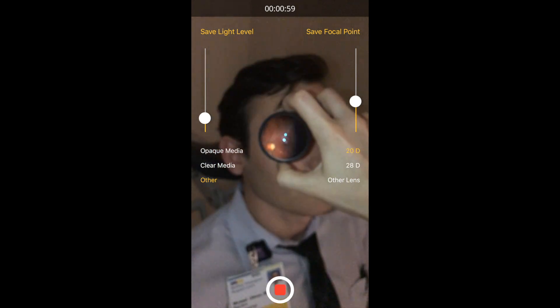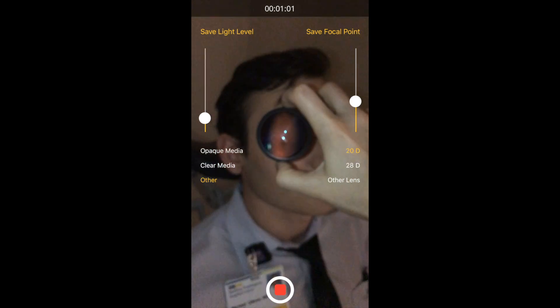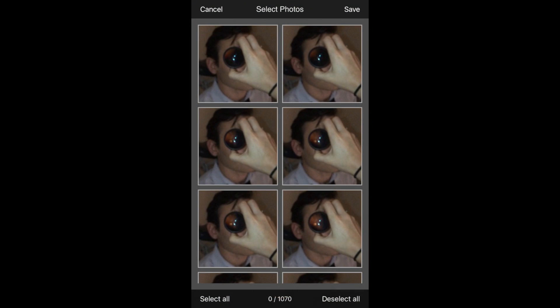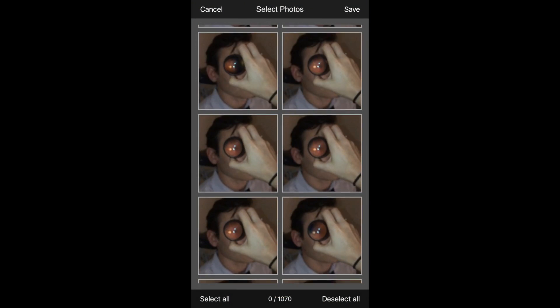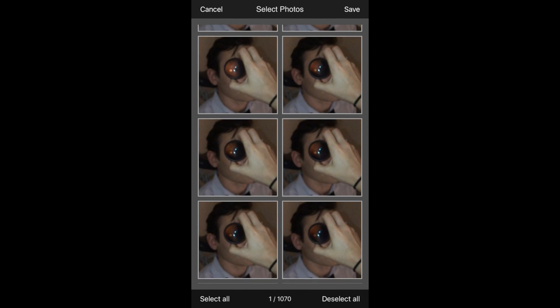For the photo burst mode, after you're done and feel like you've captured a decent portion of the retina, you're then able to select which photo you like best. Keep in mind it takes a lot of photos, so don't keep photo burst on for a very long time.